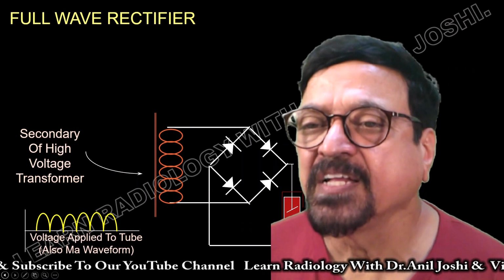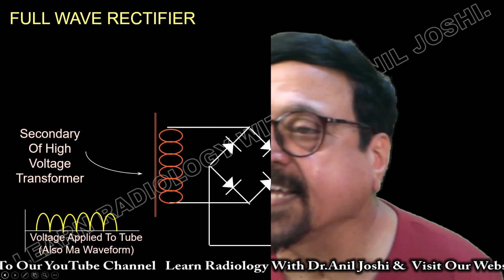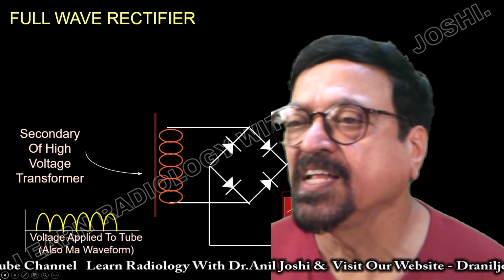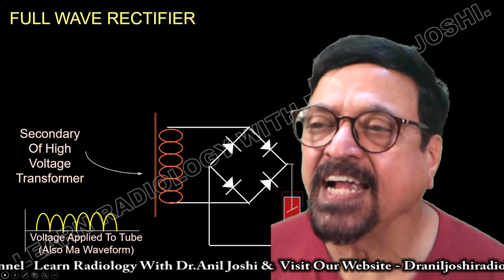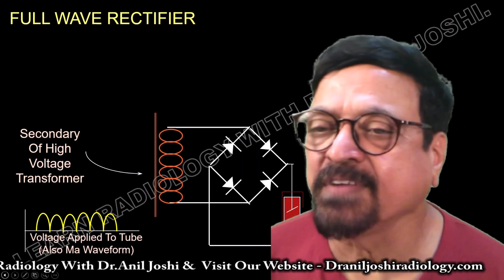Now this is the secondary of a high voltage transformer. Here you see how they are connected. Then you will know how a full wave rectification is achieved. Now whichever is coming from the upper side can go only in one direction, and whichever is coming from the downside is also going in one direction.